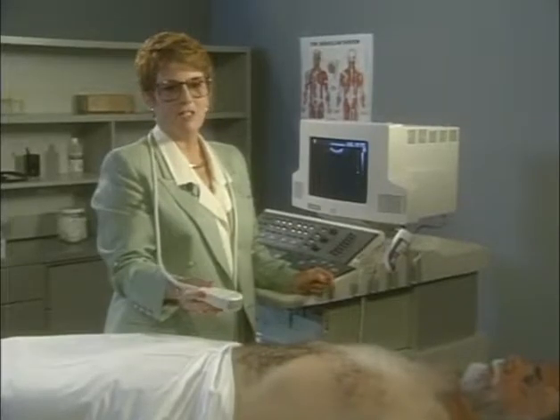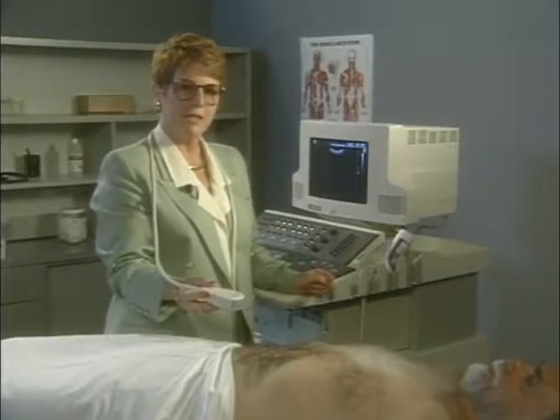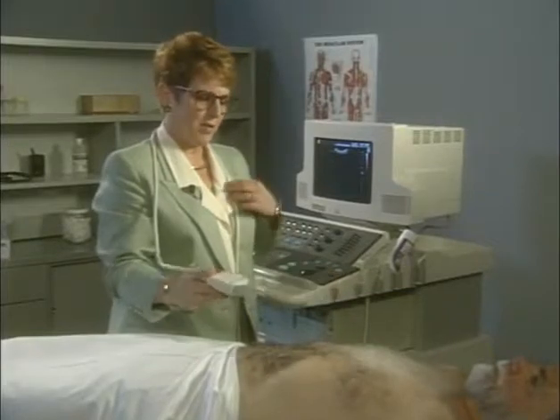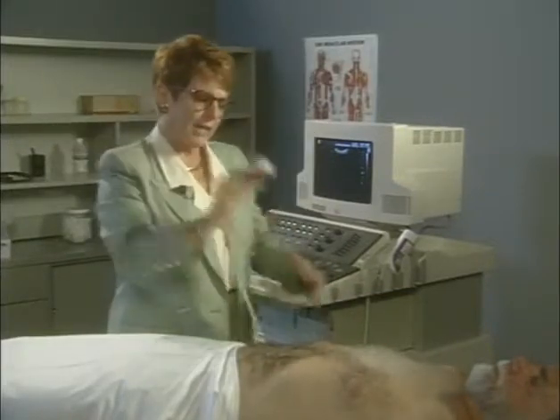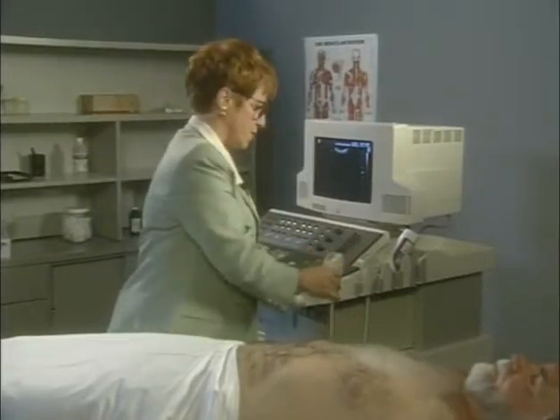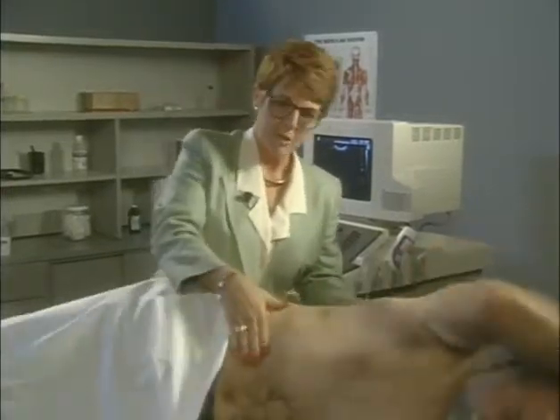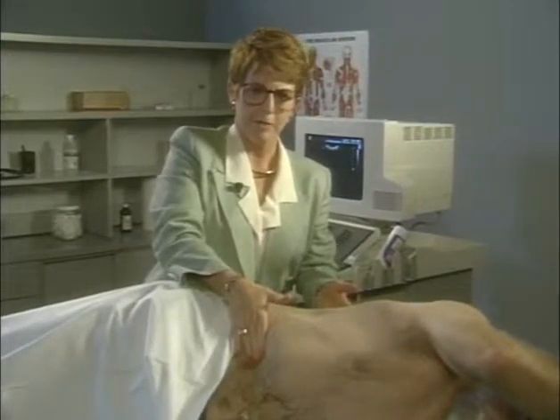In very thin patients, the kidneys may be imaged with the patient in the supine position. For the majority of patients, however, they will need to be moved to a lateral decubitus position so that the kidneys can be interrogated by moving the beam between or under the ribs.